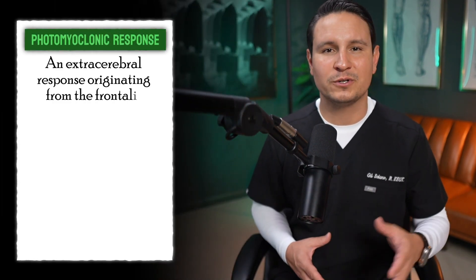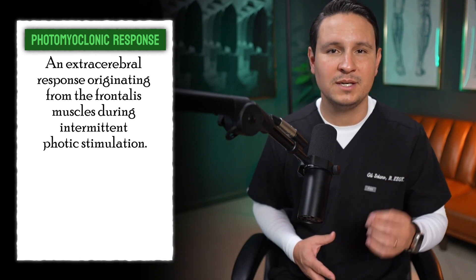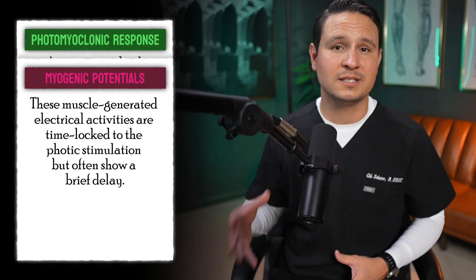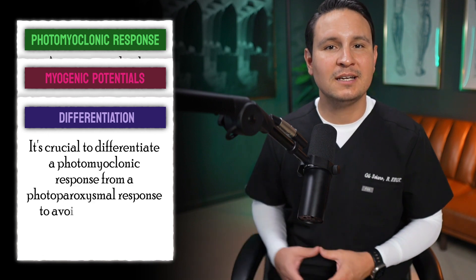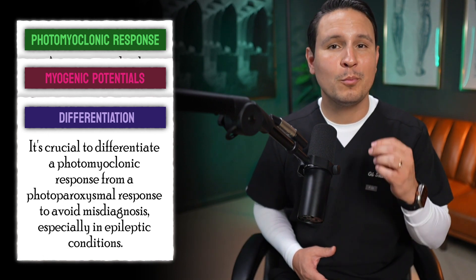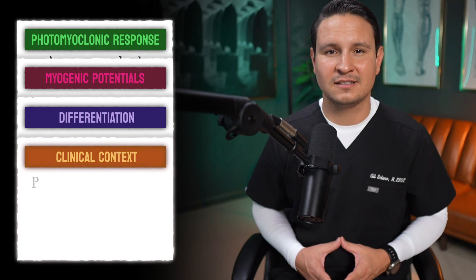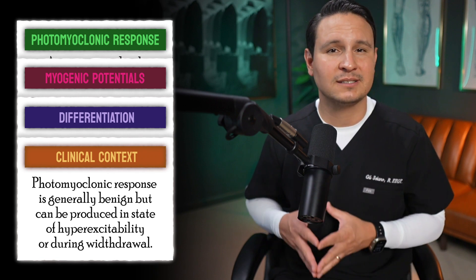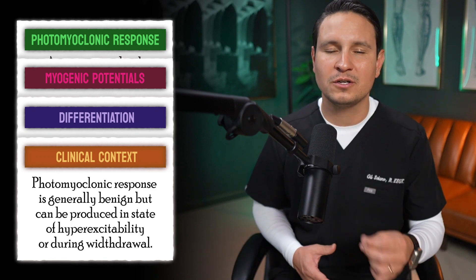To summarize, here are the important parts to remember. Photomyoclonic response: an extracerebral response originating from the frontalis muscles during intermittent photic stimulation. Myogenic potentials: these muscle-generated electrical activities are time-locked to the photic stimulation but often show a brief delay. Differentiation: it's crucial to differentiate a photomyoclonic response from a photoparoxysmal response to avoid misdiagnosis, especially in epileptic conditions. Clinical context: although generally benign, the photomyoclonic response can be more pronounced in states of hyperexcitability or during withdrawal, offering potential insights into a patient's neurological status.